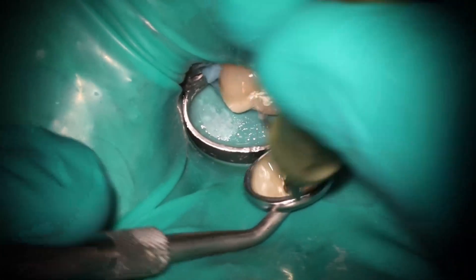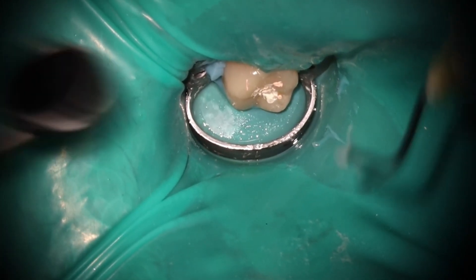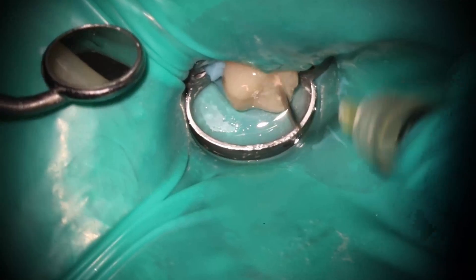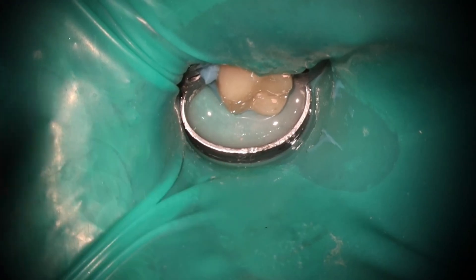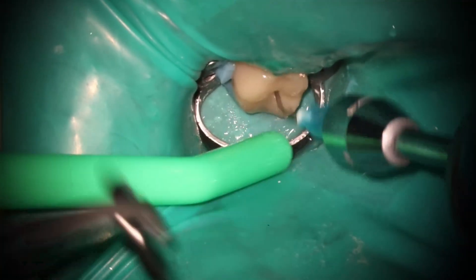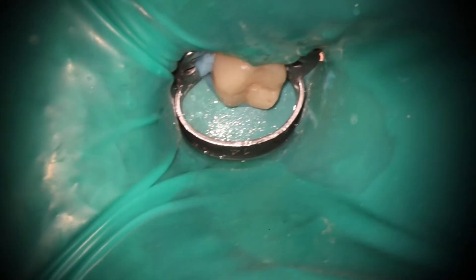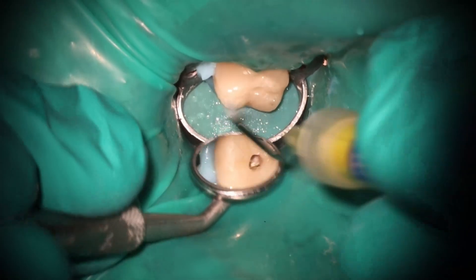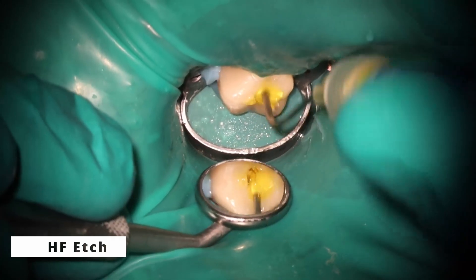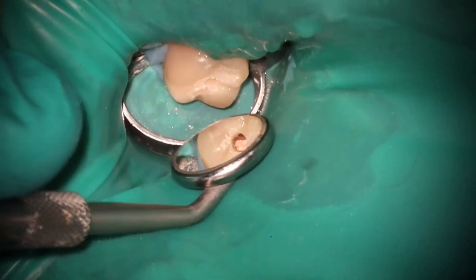The only thing here is on that distal, I didn't quite push down quite as hard or as far. Sometimes I will wait to do the x-ray until I use the pac-mac just to make sure I'm not extruding any material at the apex, because we don't want that. In this case, I did not do the pac-mac until after the x-ray. One trick with E-max lithium disilicate or PFMs: you want to use hydrofluoric acid as an etching material to make sure that you etch the porcelain so you have something to bond to.